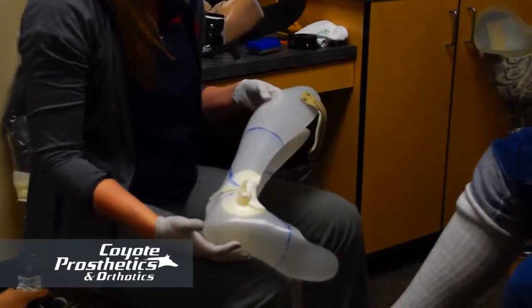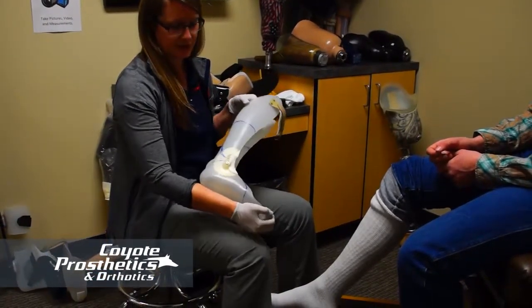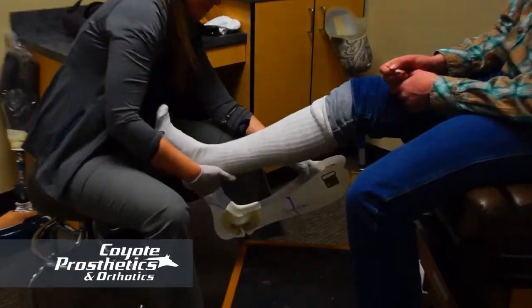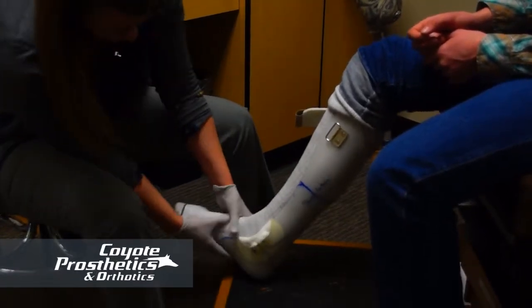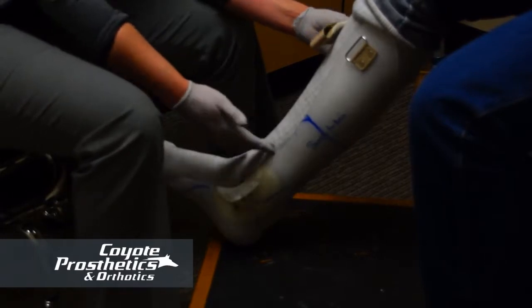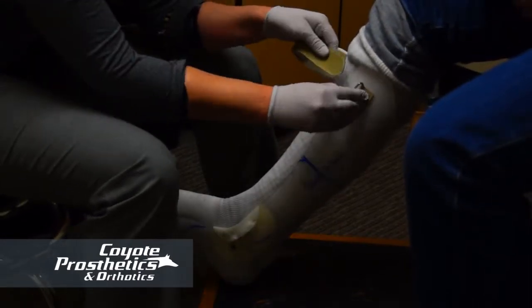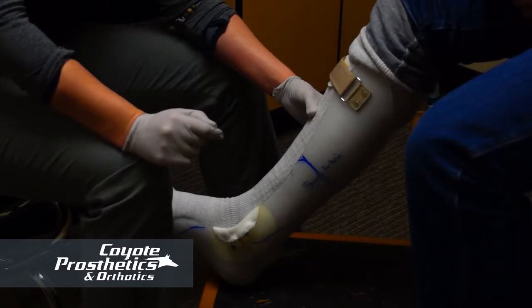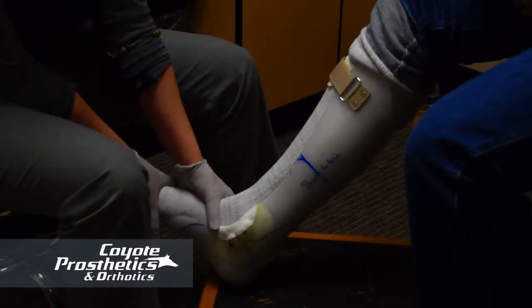There are several different types of braces — this is an articulated AFO, so you can move your ankle up, but there's a stop so you can't move your foot down. To put it on, drop your foot into it and make sure your heel is all the way back. Depending on your specific brace, you'll probably have a number of Velcro straps. Thread it through the chafe and tighten it — you want it snug, but not so tight that you lose circulation. It should hold the brace in place.